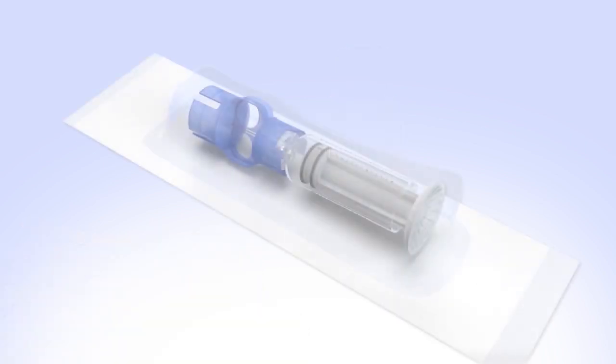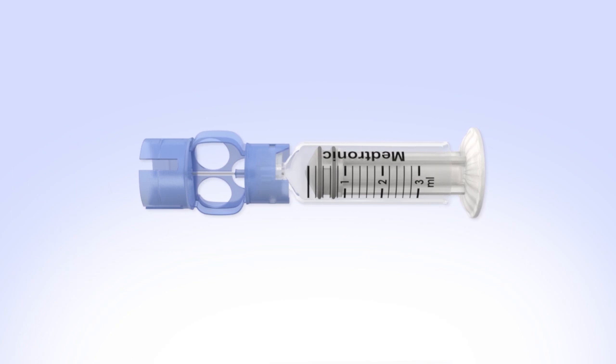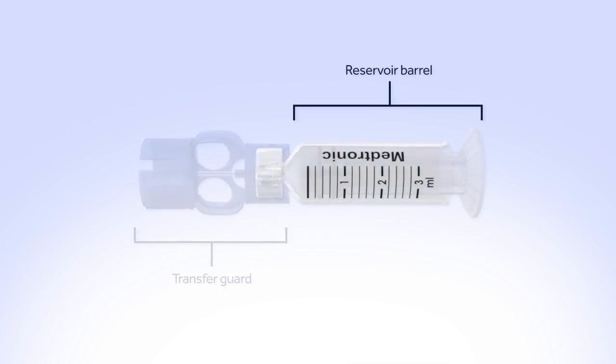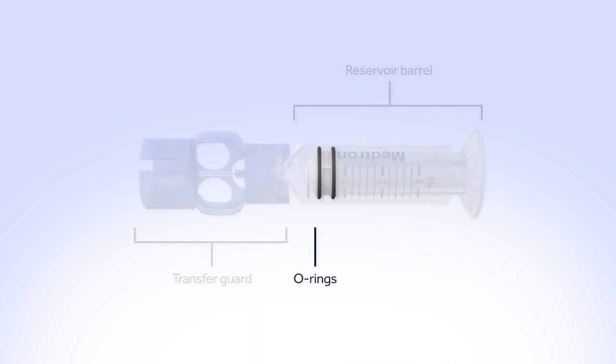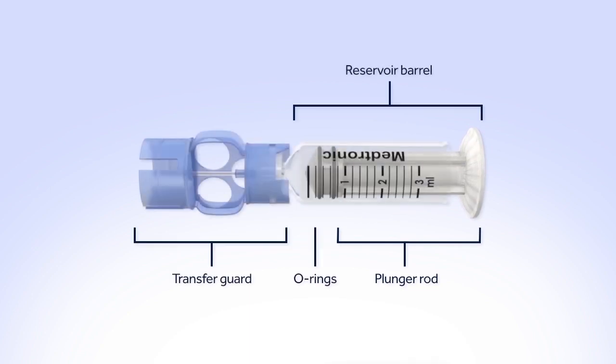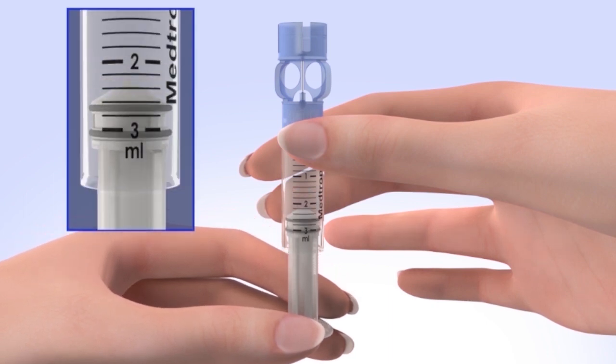Remove the new reservoir from the package. Let's stop for a minute and look at the different parts of the reservoir. The transfer guard attaches the reservoir to the insulin vial so it can be filled with insulin. The reservoir barrel holds your 2-3 day supply of insulin. The O-rings prevent insulin from leaking out of the reservoir. The plunger rod is used to fill the reservoir with insulin. Now, pull the plunger so the top of the O-ring is positioned at the amount of insulin you plan to put in the reservoir.